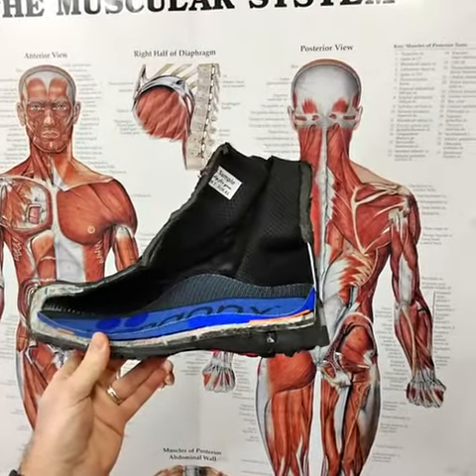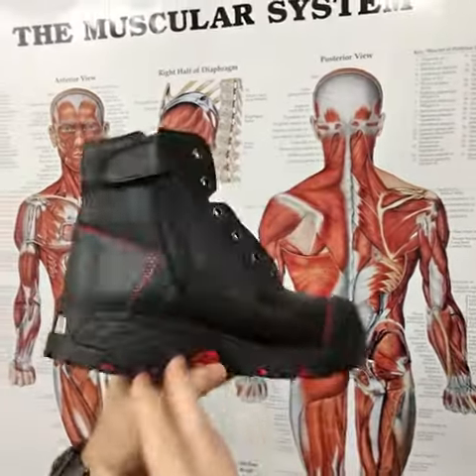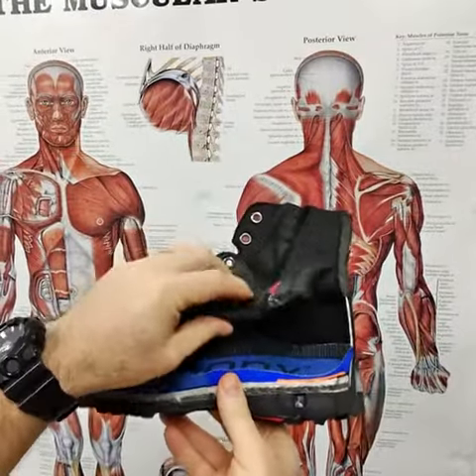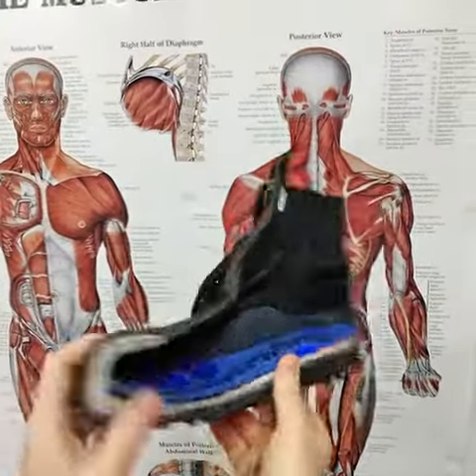How to stop heels slipping with custom-made orthotics. Using the Ergonix Elements Work Boot as an example, the best boots to fit an orthotic into are a lacer.